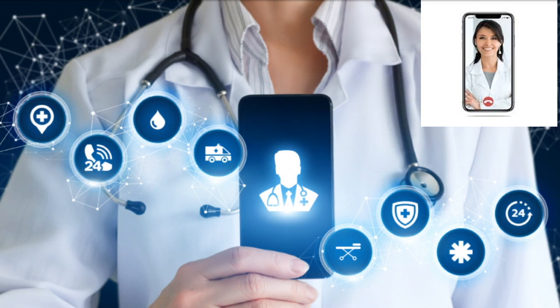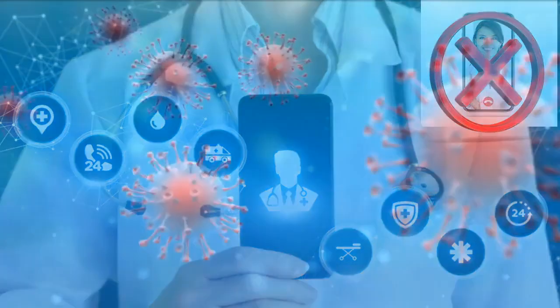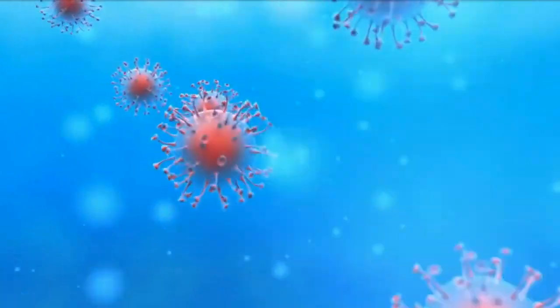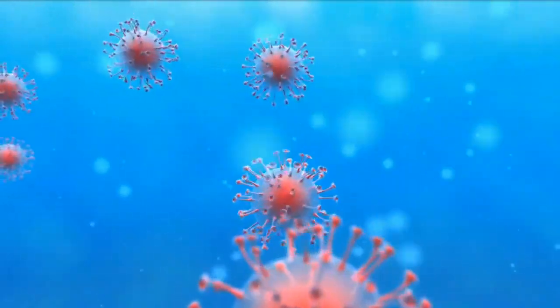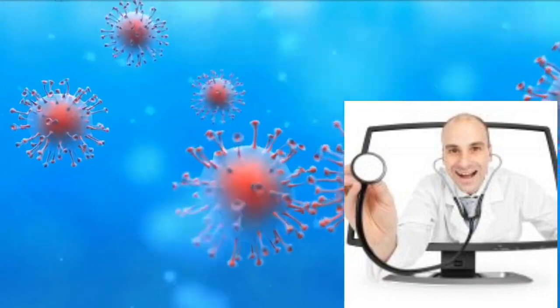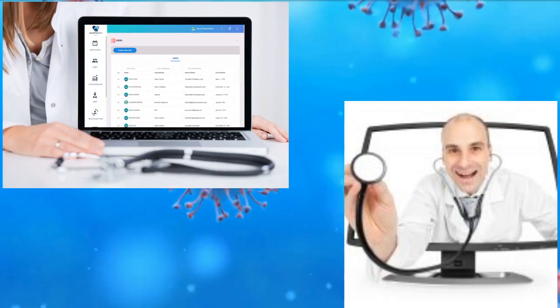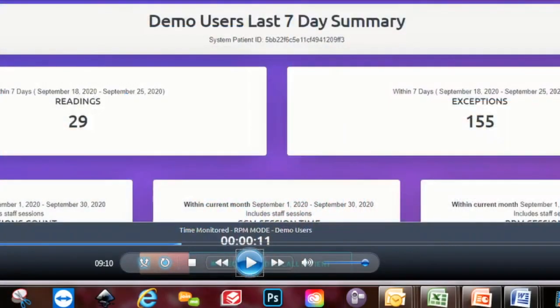Both parties have the ability to turn the video portion off, and also both parties have the ability to redirect the camera outward so the device camera may be utilized to position it to show a wound or movement from a body part. Due to COVID-19, the regulations changed so physicians can bill for telehealth services without the traditional face-to-face and sign-up procedure. The physicians have been using our platform for RPM as well as telehealth.